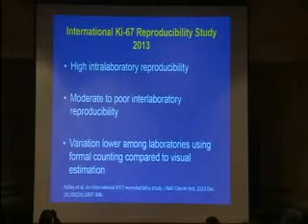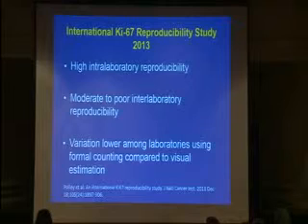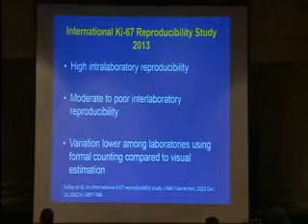So that's the pitfalls in HER2 testing. Yesterday there was a very nice lecture that went over in detail the Ki67 guidelines and issues. I'm not going to go over that in detail.